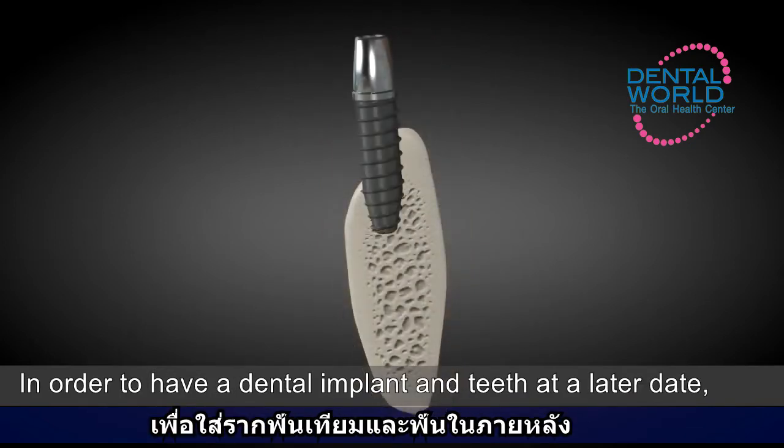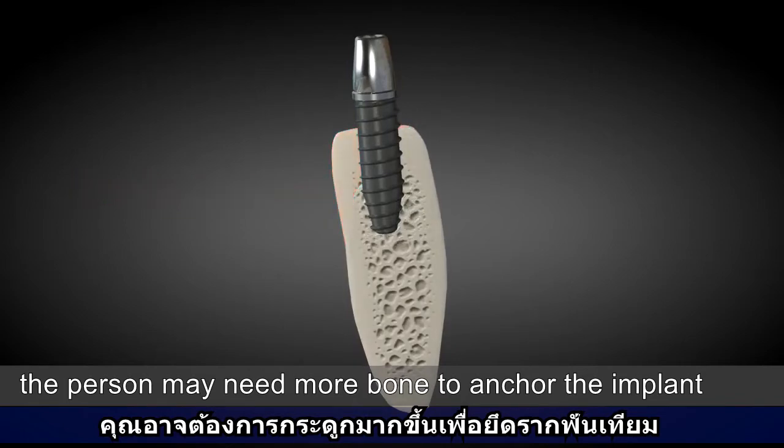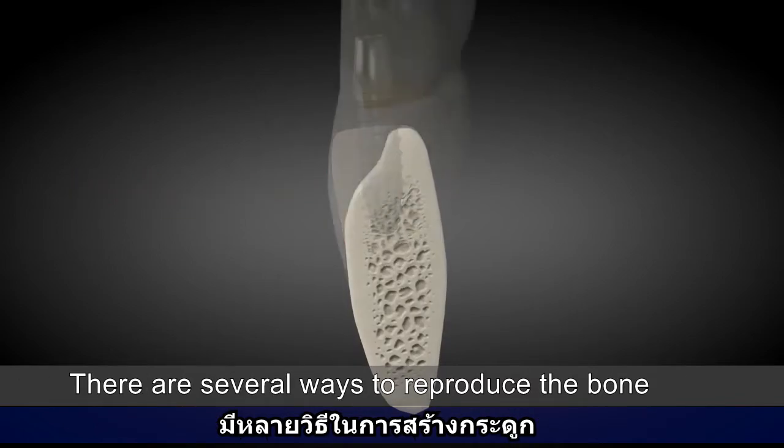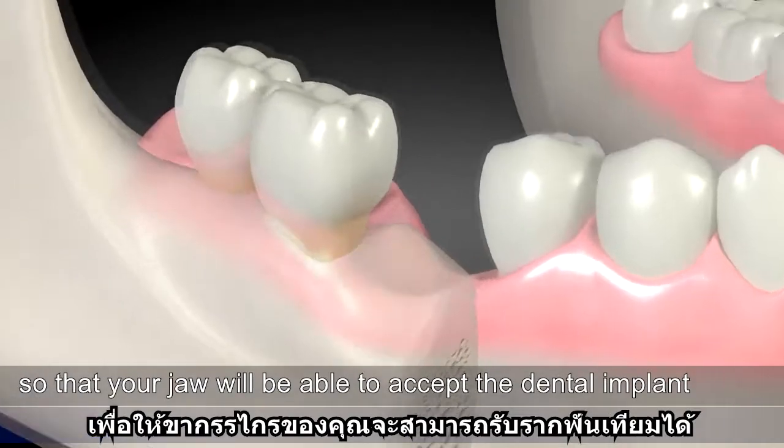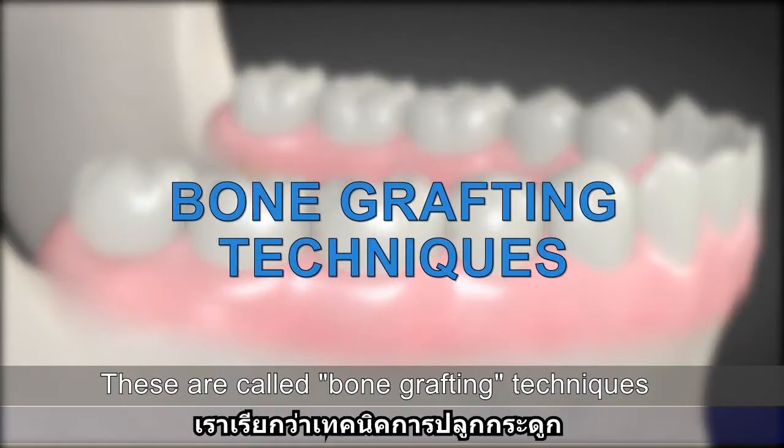In order to have a dental implant and teeth at a later date, the person may need more bone to anchor the implant. There are several ways to reproduce the bone so that your jaw will be able to accept a dental implant. These are called bone grafting techniques.